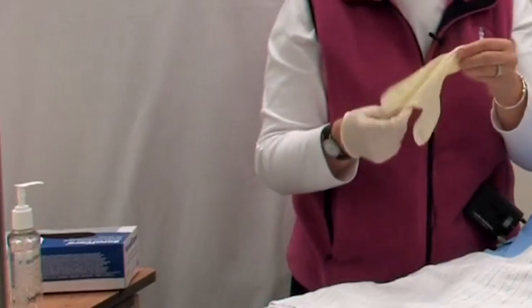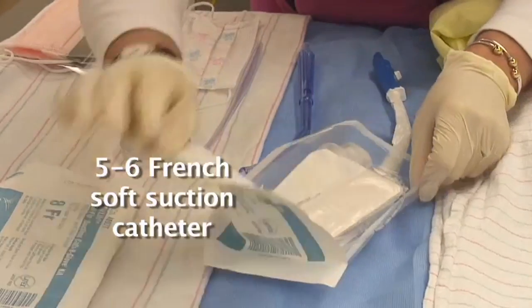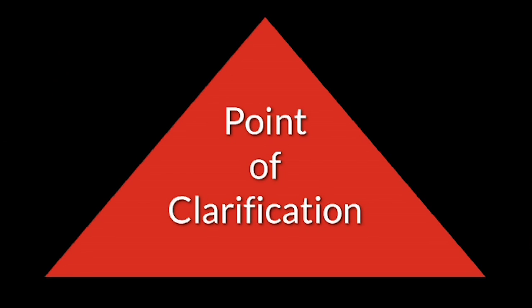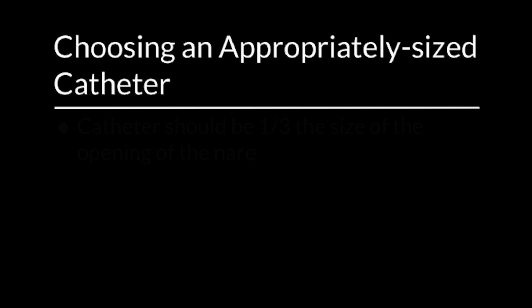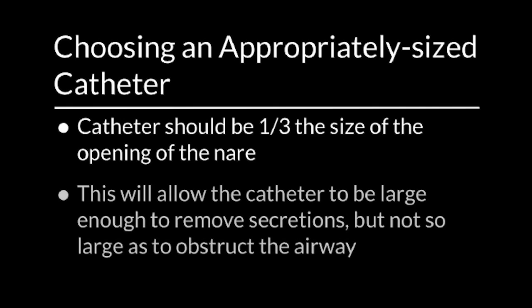I am going to use a size 5 or 6 soft suction catheter to suction this baby. You might use a larger catheter such as an 8, 10, or 12 depending on the size of your patient. It is important to select the appropriately sized catheter based on the size of the patient's nares — the catheter should be one third the size of the opening of the nares. This will allow the catheter to be large enough to remove secretions but not so large as to obstruct the airway.